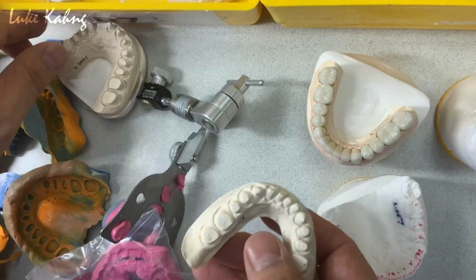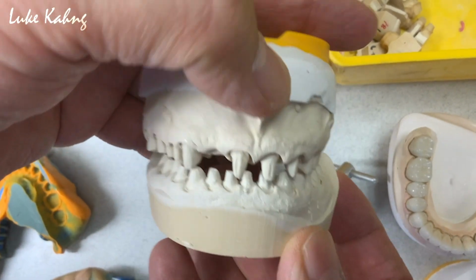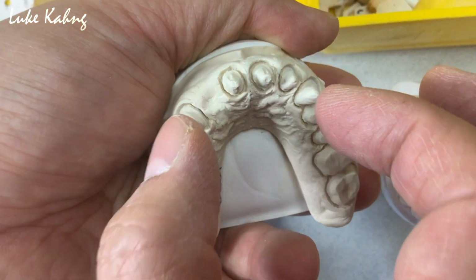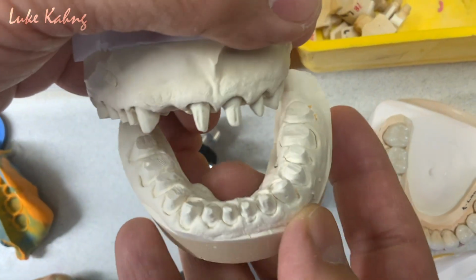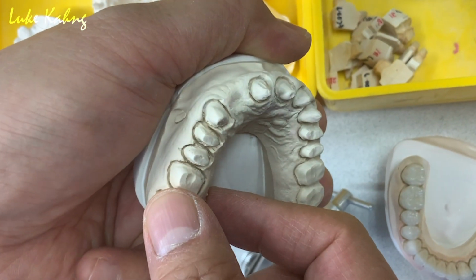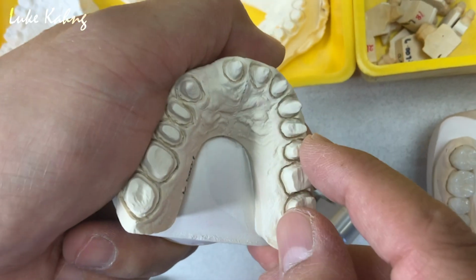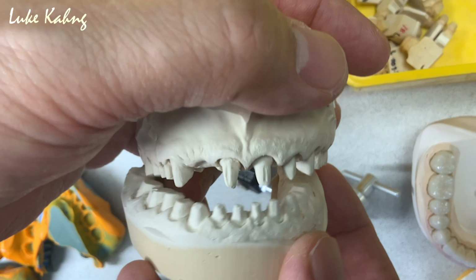Now, regarding the bite, whenever they have the upper prep and lower prep, right? All the time the patients or doctors lose this vertical dimension. So we don't know their bite. So I recommend they set the temporary 6 unit first, and then open here, and then put the temporary back, and then bite it. Okay, one side. And also put back the 4 temporary. Here still temporary, so open it, take everything out, and then bite it. So 2 bites I got. Put in the temporary, take it out, prep, and then biting. That's what we call cross mounting the bite.